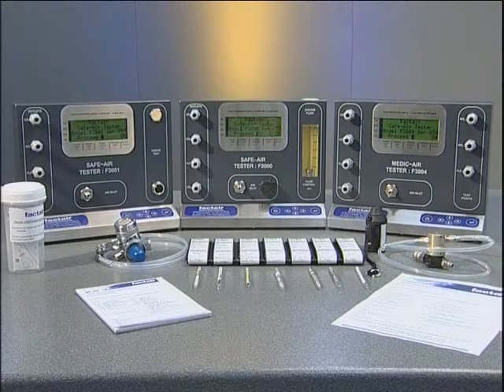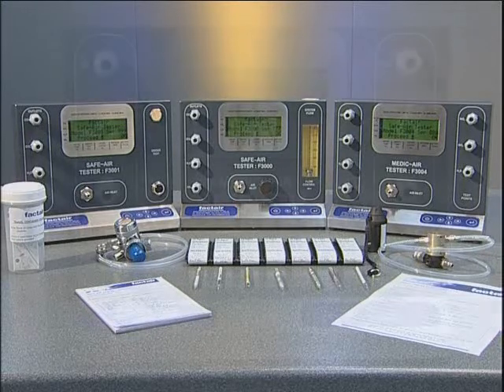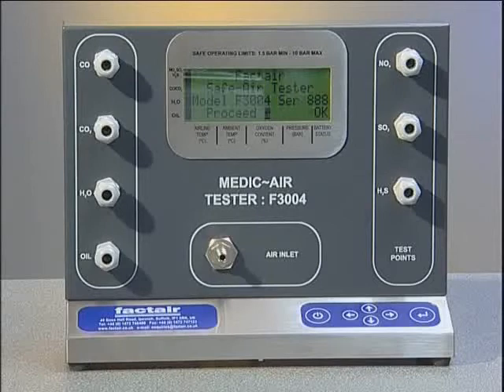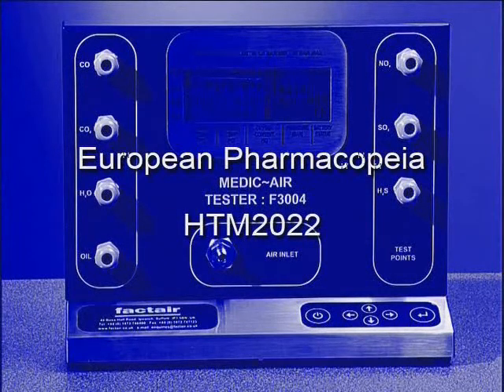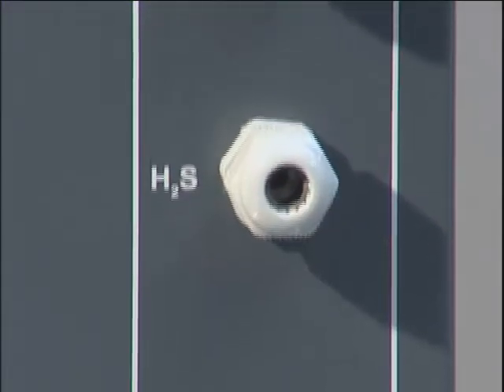Safe air testers are designed to provide a quick and easy method to carry out accurate periodic testing of breathing air supplies. The F3004 Medic-Air tester is designed to provide a quick and easy method of establishing the quality of medicinal air, as generally used in surgical, medical and dental applications. This is to the limits specified by European Pharmacopoeia and previously in the United Kingdom, HTM 2022. In this example, we'll be testing a typical medicinal air system.